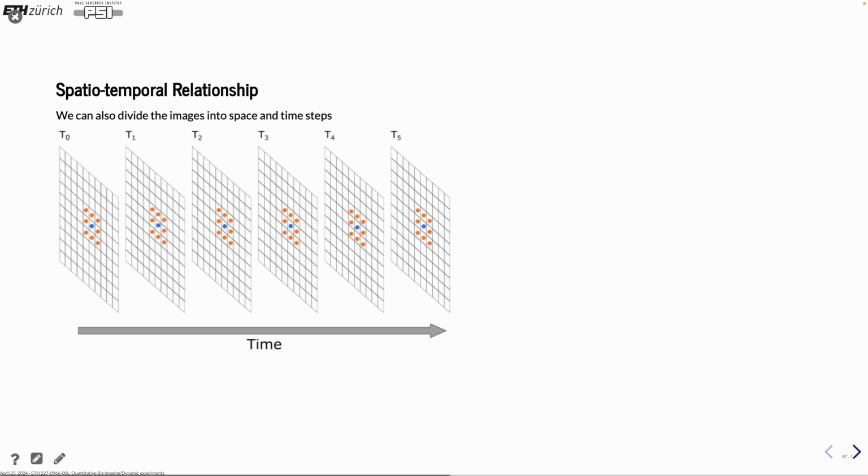And one thing with these filtering techniques in the time frames is, in principle, you can apply normal filters. So seeing the 2D data as 3D, you can just do a 3-dimensional filter, maybe with an asymmetric shape, say n by n in space and m in time. And with that, you can also tune how the filter is working.